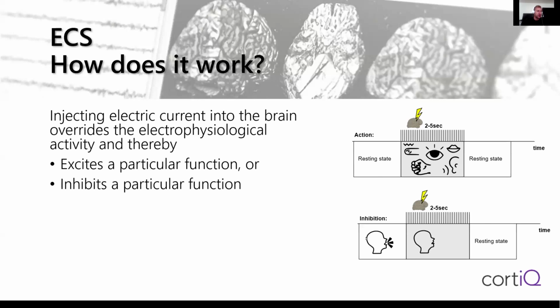For the inhibition, it works a bit different. For the inhibition, the patient is not in a resting state, but doing a baseline task. Here, for example, the patient is performing a verb generation, picture naming, or simply a communication task. And then during the stimulation, again of a few seconds, this task will be interrupted. And then afterwards, the patient is able, for example, to speak again. So by that, we again understand what is the functional region associated to this speech interruption.